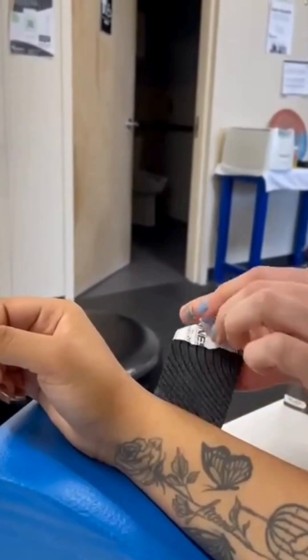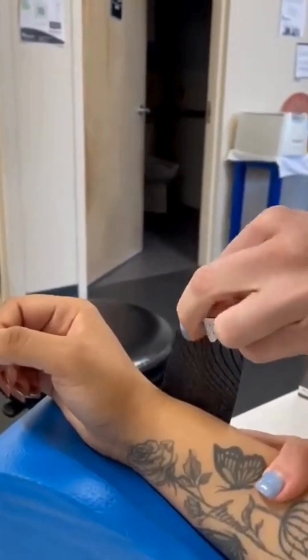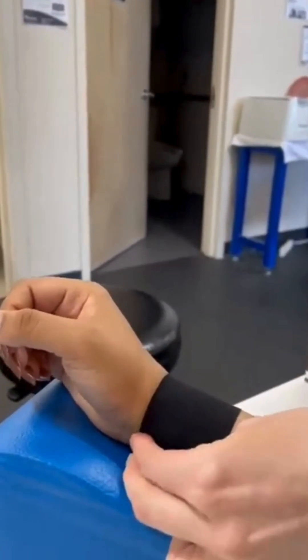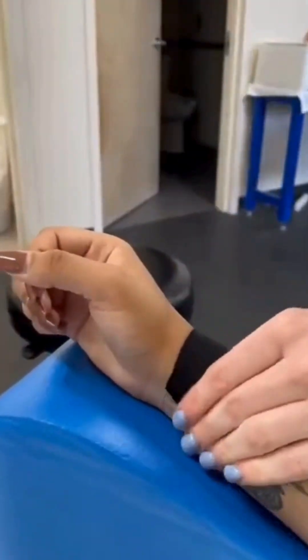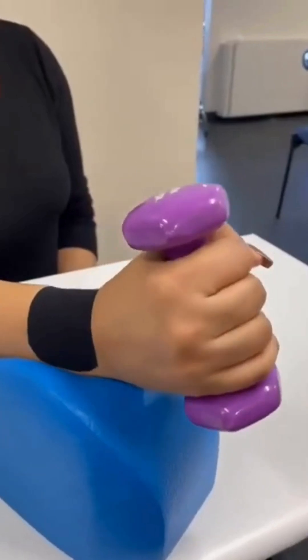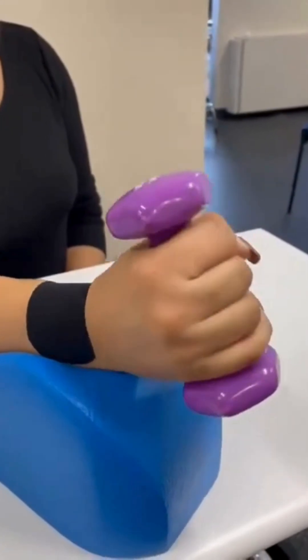Once the taping is complete, have the patient repeat the movement that initially caused pain. See if there is relief comparable to the pre-taping test. Now we can see the patient can perform the initially painful motions with little to no discomfort.